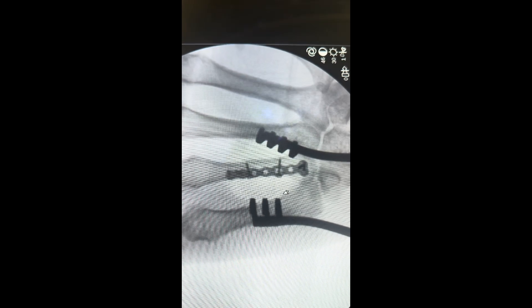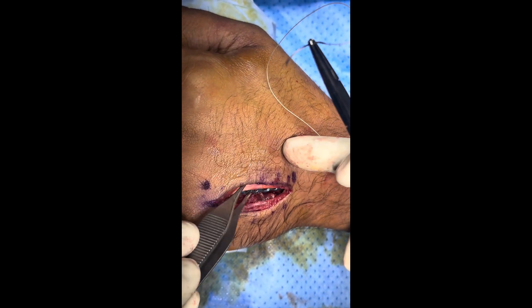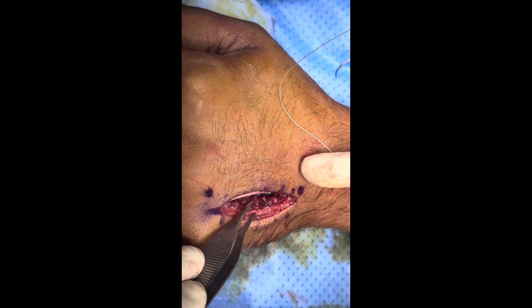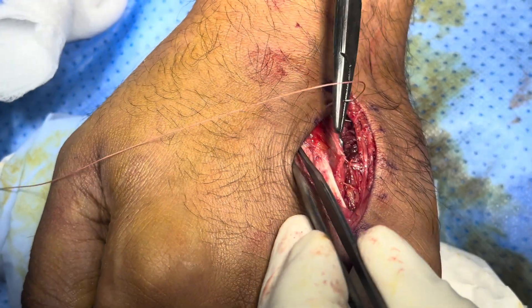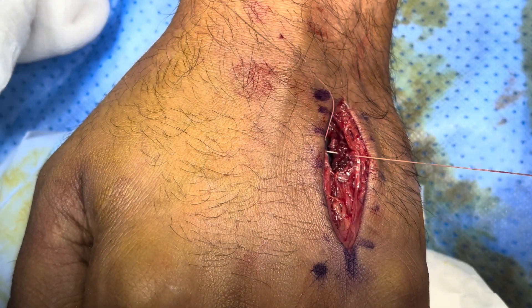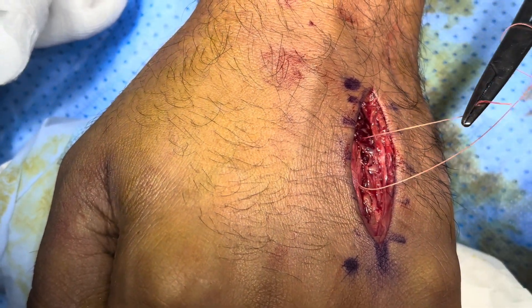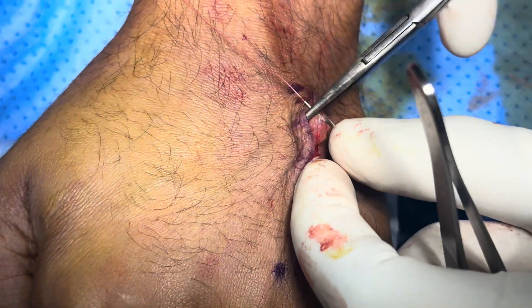I'll close the fascia — this is the extensor tendon and this is the digital nerve, so I'm going to preserve these. Now I'll close the fascia and skin. This is the fascia over the plate; we are closing this. This is the dorsal interosseous — we have to cover the plate. The muscles will help in the vascularity and help in the healing of the fracture. This is the fascia over the tendon and we have to close it properly.